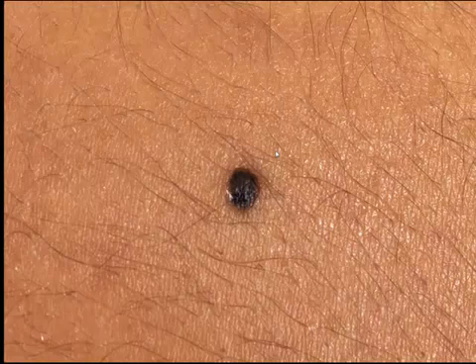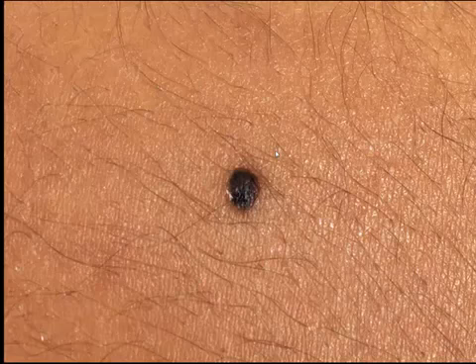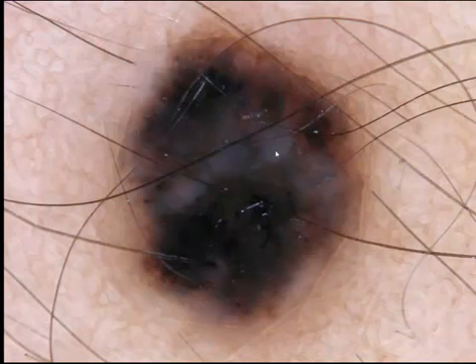Now, always look for clues when you see a structureless lesion. You have to look very carefully sometimes. I'll tell you the last clue. This is a lesion that is clinically melanoma or a nevus, very darkly pigmented. And now here you see it's a structureless lesion.